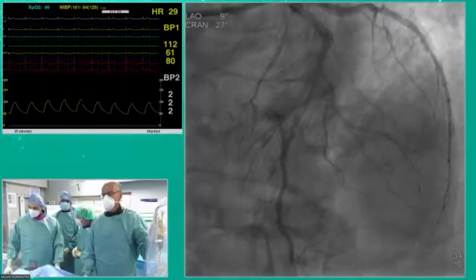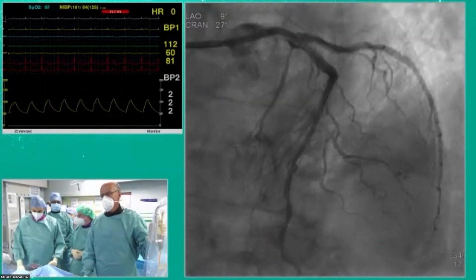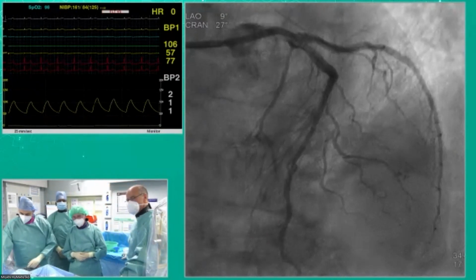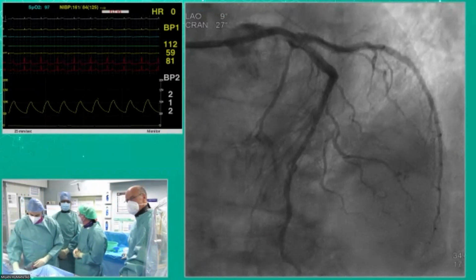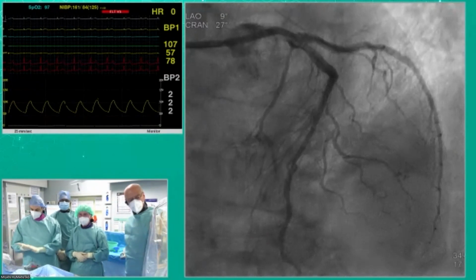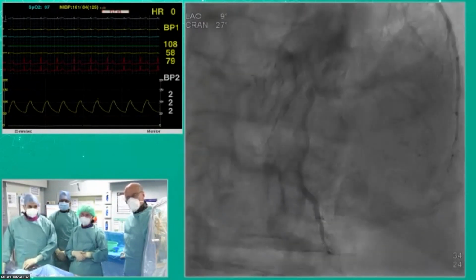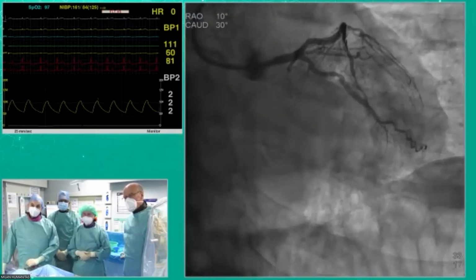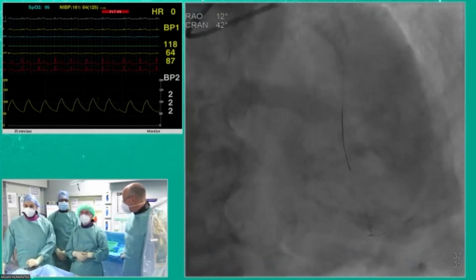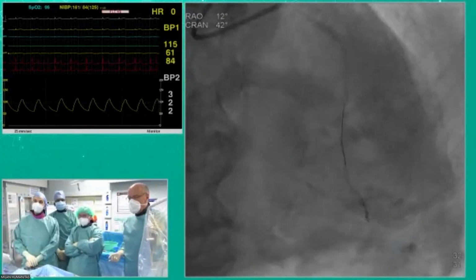And believe it, I asked the patient, how can we make you feel better? He said, I already feel excellent. There is some dissection, I would say 3 centimeters distal to the diagonal. You can see here, in the distal LAD. But that's not flow limiting. And of course, if you start to stent there, then you probably need more. We tried spot stenting. It never worked. No, I think it's okay.